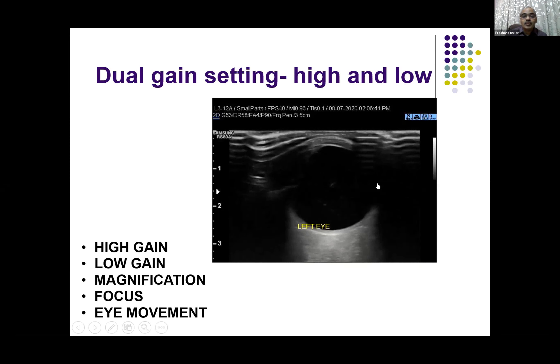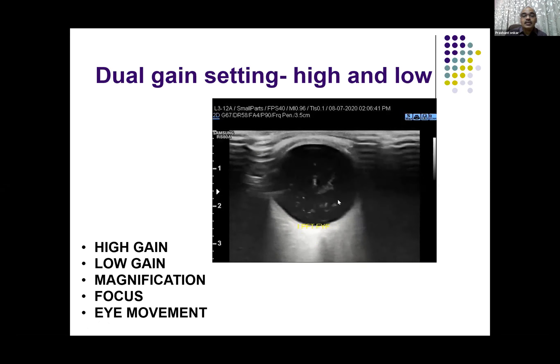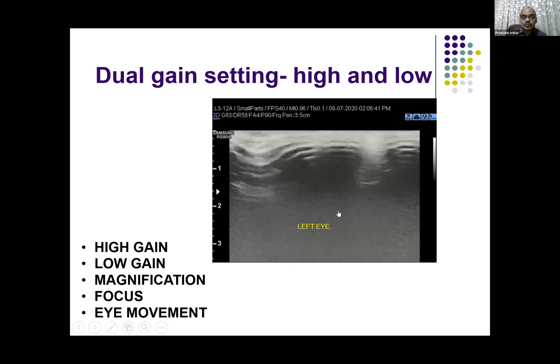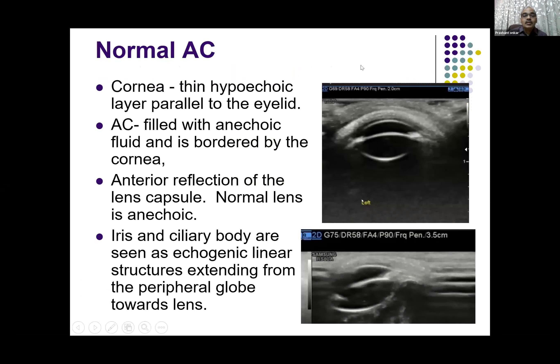The patient has to be trained for eye movement. You can see here that the eye movement contents are very freely mobile. In a normal eye, the cornea is seen as an anechoic or hypoechoic layer parallel to the eyelid, and the anterior chamber is almost always anechoic.